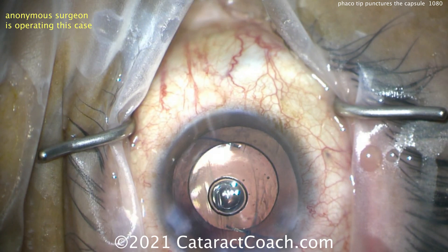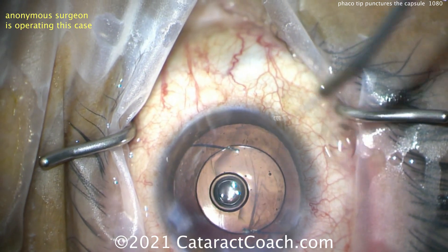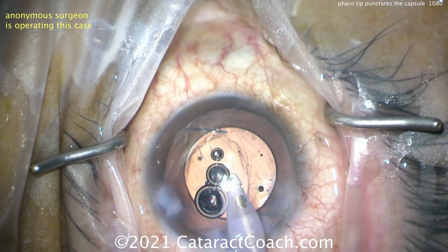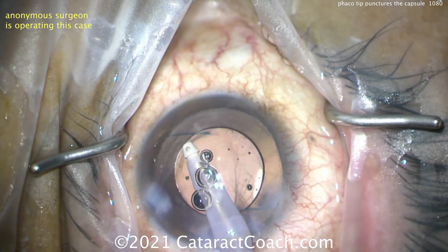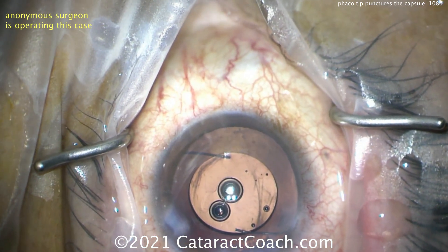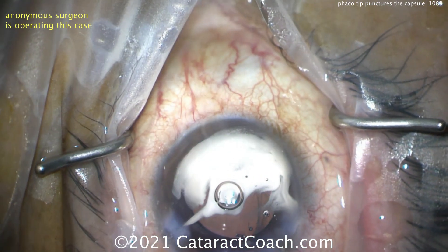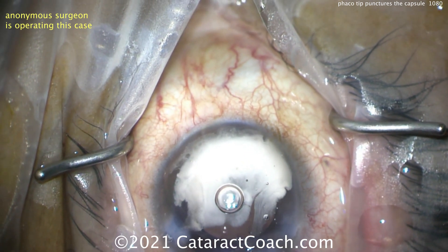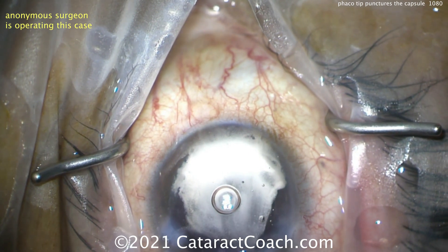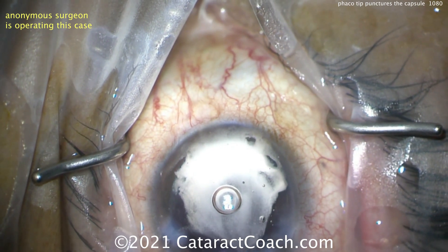It's now in the correct anti-S position, but did the bag open up more? That straying haptic, when it went around in the wrong direction — did it puncture the capsular bag further? Is the bag further ripped? It kind of looks like it. I don't think we can call this done — I think we have more vitreous prolapse. That lens doesn't look too stable. Let's put in triamcinolone.